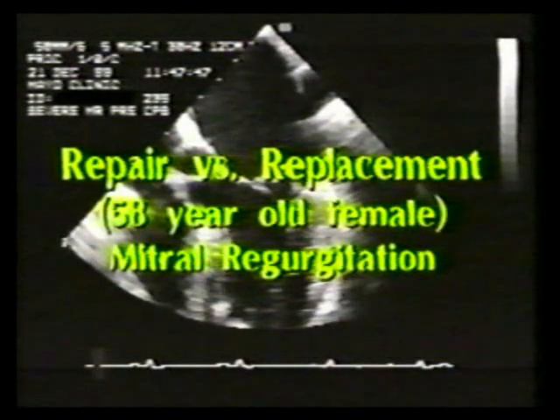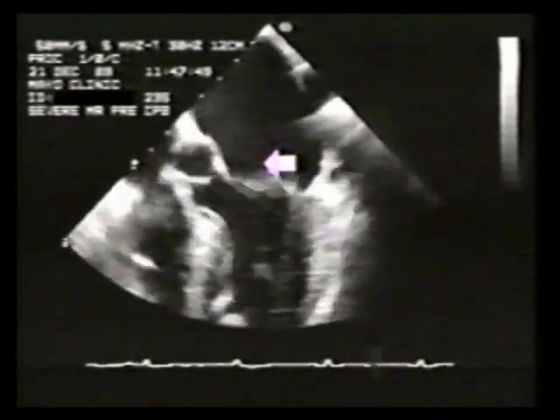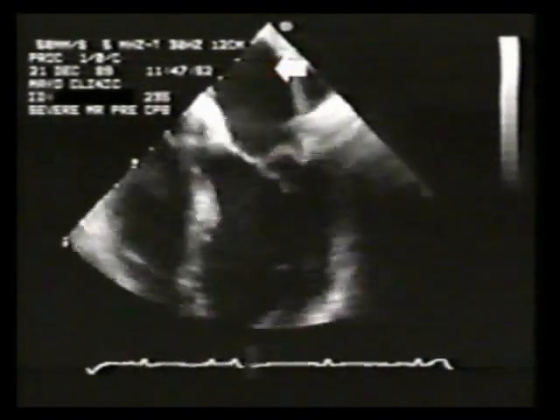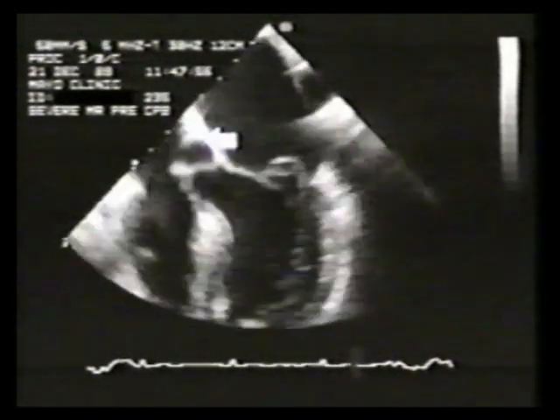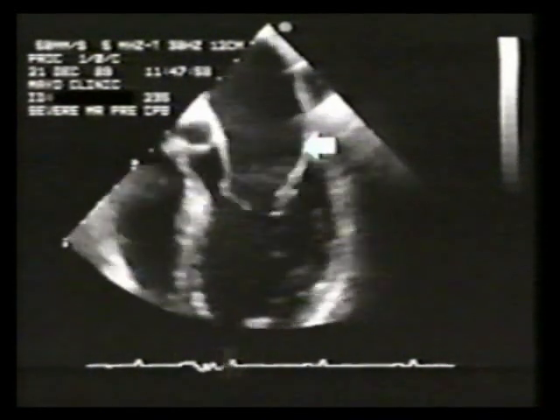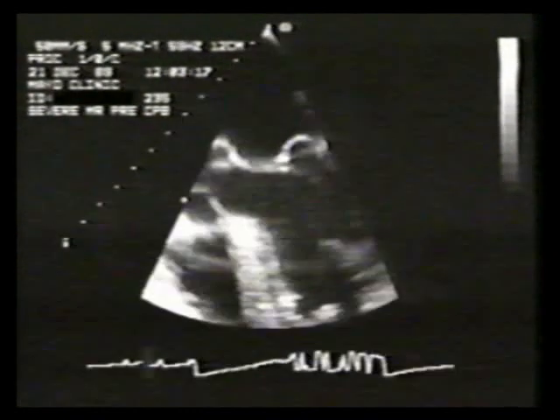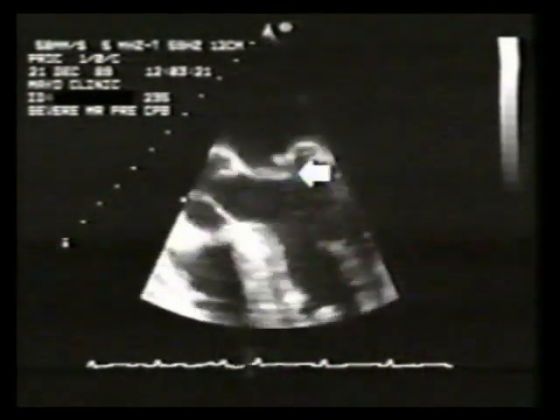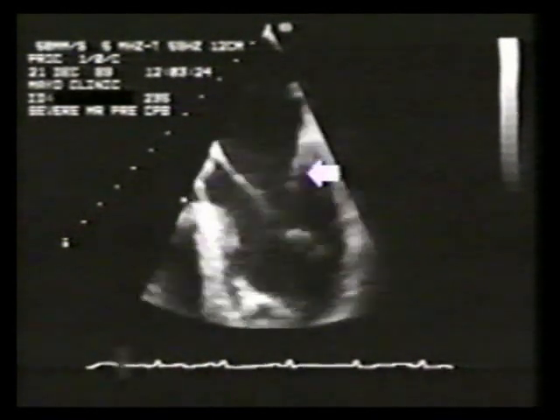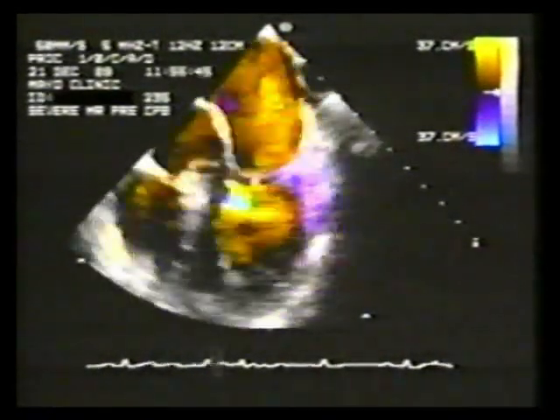This is an example of a patient being considered for mitral valve repair versus replacement. On transesophageal echocardiography, there is obvious prolapse of the posterior leaflet of mitral valve. The left atrium is only moderately increased in size. The left ventricle is hyperdynamic. Note that portions of the mitral valve support apparatus flail into the left atrial cavity. The posterior leaflet lacks coaptation with the anterior leaflet and should be associated with severe regurgitation.